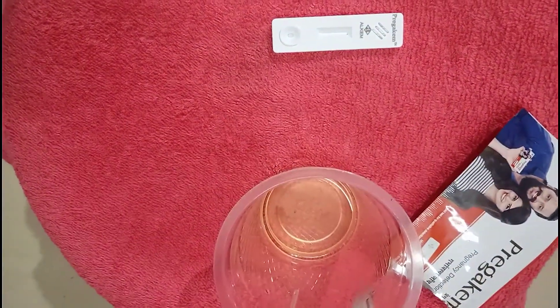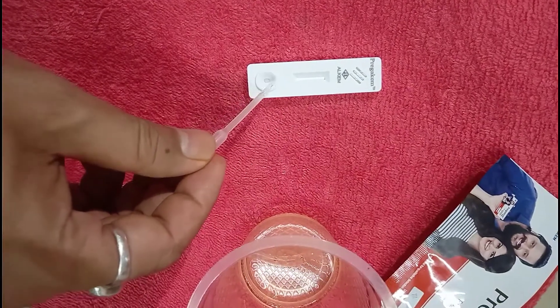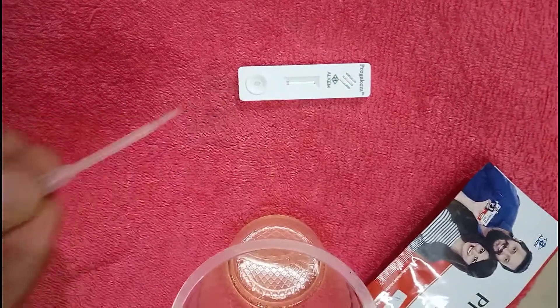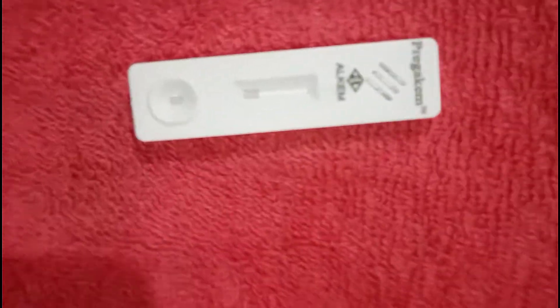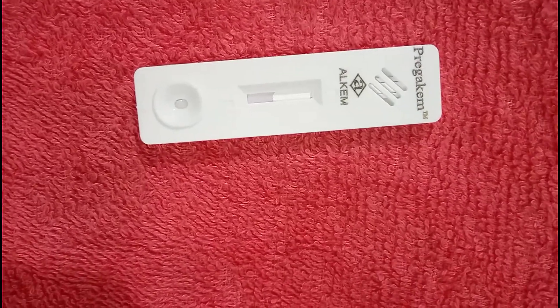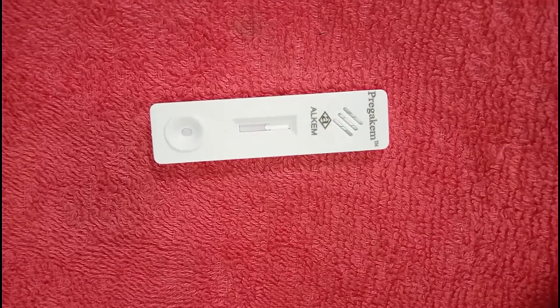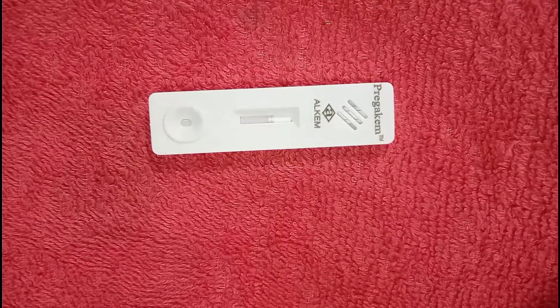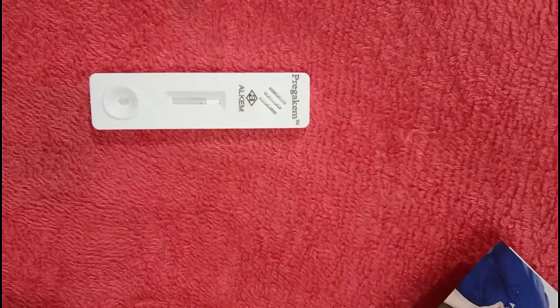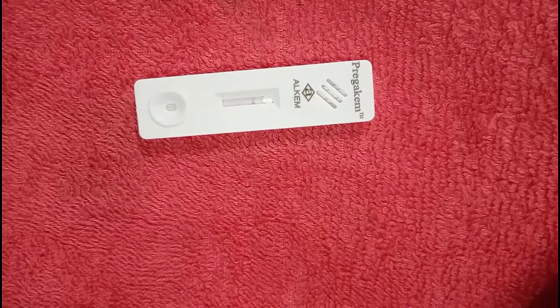Now I am going to test one sample. I have collected urine from the woman and will put two to three drops into the dipper — that is enough. The urine will flow to the test window and we have to wait five minutes to get the result.